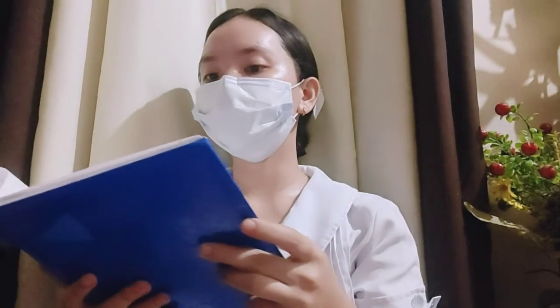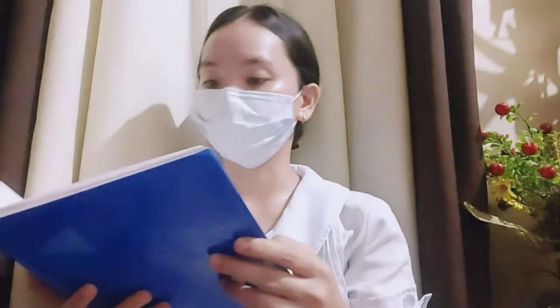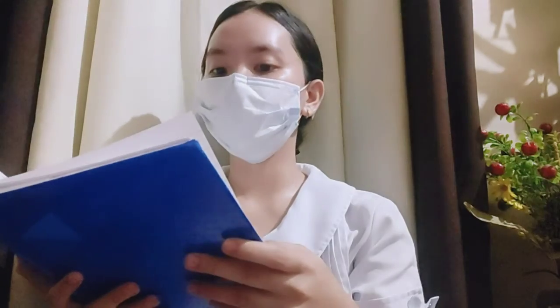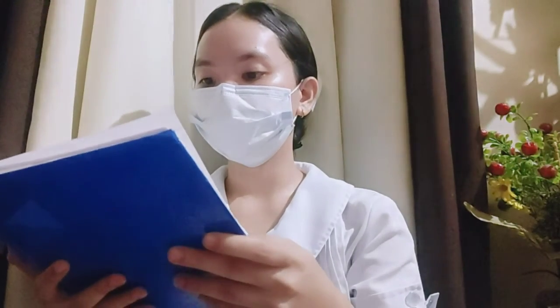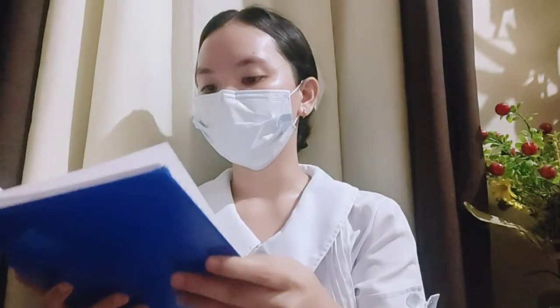February 12, 2022, patient underwent a nasogastric tube insertion. French 12 nasogastric tube size was used. Measurement of insertion from the tip up to the end of exposed tube is 51 cm. No X-ray was taken. Gastric contents color is tan. pH content is 4.0. This established acidity. This means that nasogastric tube is placed in the stomach properly.